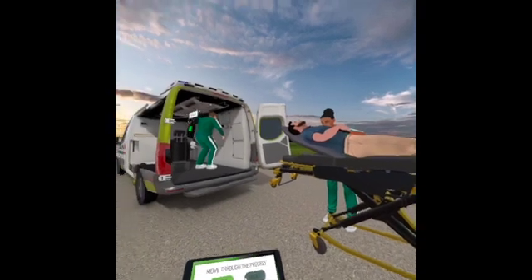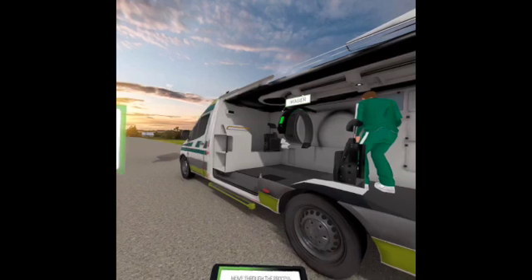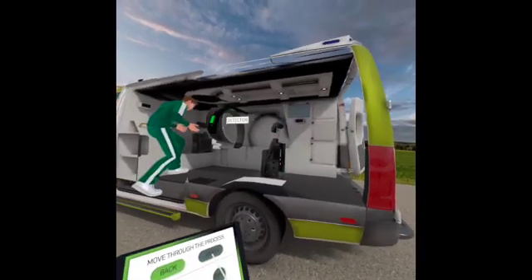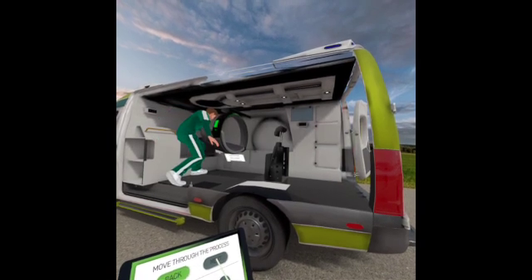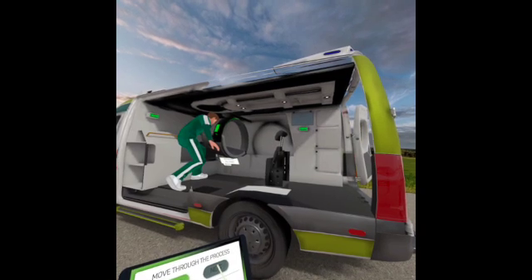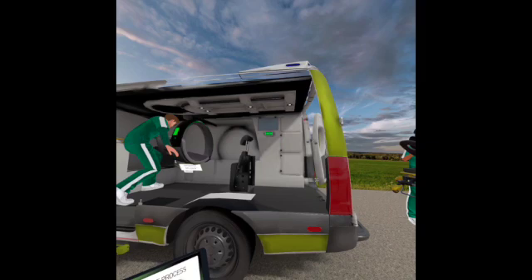The stroke paramedic releases the imager from its stowed position against the wall and swings it out into the operating position. They then release and lower the detector and slide it forward to connect to the imager. The detector delivery mechanism is slid up and away from the detector. Once in the correct position, the green indicator lights on the wall will become illuminated.